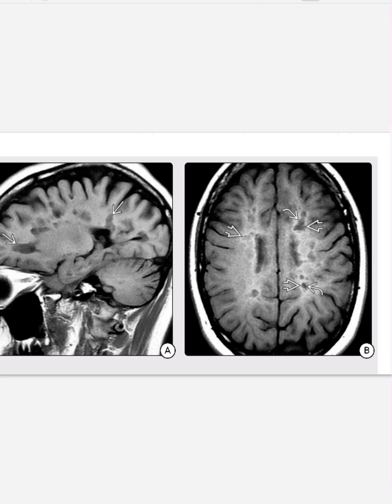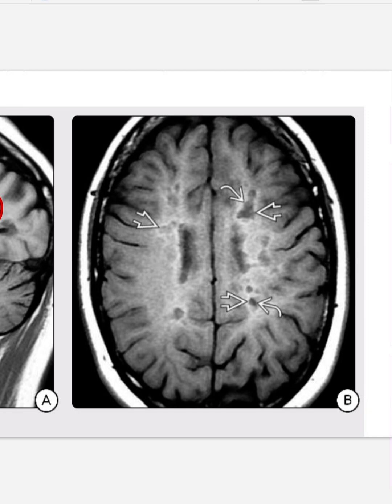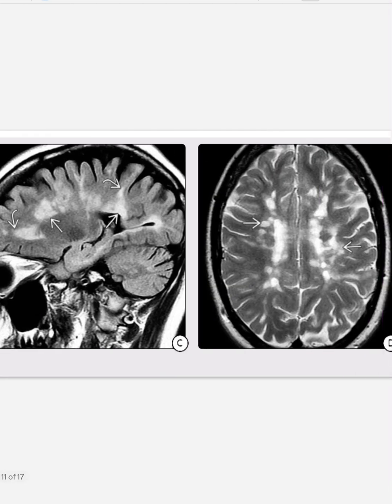The next case is a 19-year-old woman with a long-standing history. The sagittal T1-weighted image shows findings of chronic burnout lesions — volume loss with multiple hypointense ovoid and triangular lesions in the deep periventricular white matter. On axial imaging, T1 shows an ill-defined hyperintense ring surrounding the plaque, giving a distinct lesion-within-a-lesion appearance.